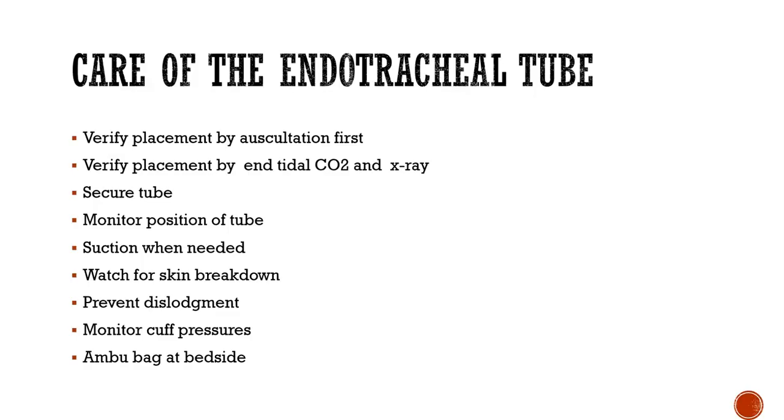They'll put a little bit of water down that ET tube, just enough to lavage it and break that clot up, and patients usually are fine after that. But if you suddenly see a drop in your O2 and the patient's bucking the vent, they very well may have plugged off. So call respiratory, get the ambu bag, and we can go from there.